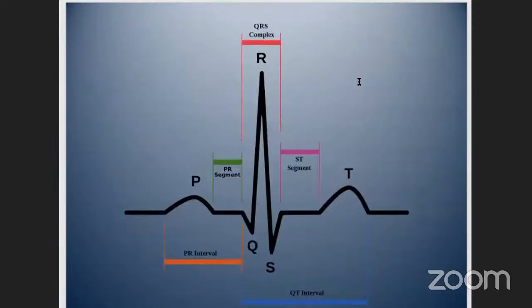So we've done our rate, our rhythm, our axis, and now we would look at our waves and our intervals. When looking at an ECG in our specific leads, we would see our P wave. We know that it is followed by the PR segment. Then classically, dependent on the lead you're looking at, we have our QRS complex, our ST segment, and our T wave. This is what is defined as normal. We can then apply normal to all of the ECGs that we look at and see if there's anything different, what is different, and that can help us to identify a potential cause for this.